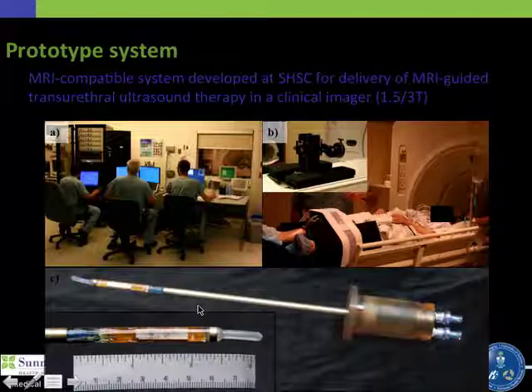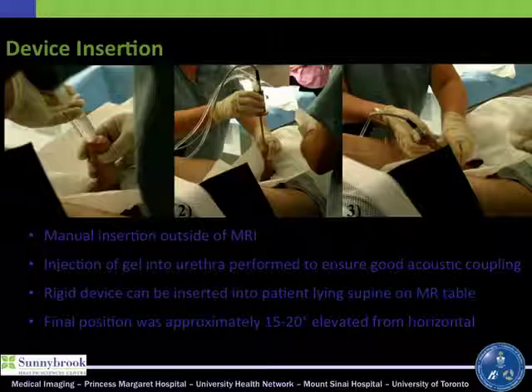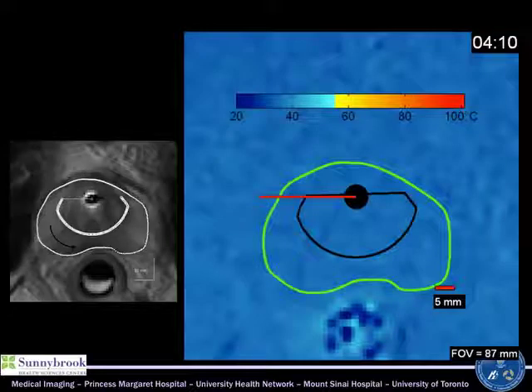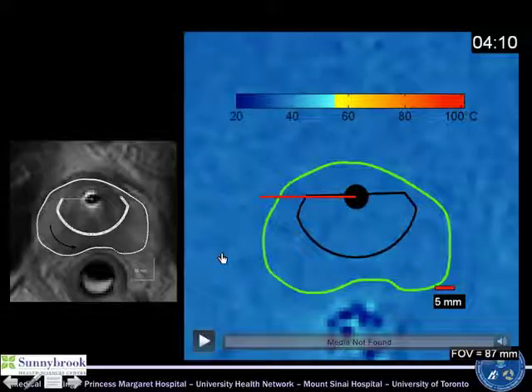This is Laurie Klotz here, and I do all the tracings for this. This is the transurethral device. This has now been commercialized, put into a commercial form with a company, and there is a trial planned in the U.S. So the urologists insert this device. It's about the same diameter as, a little less than, a cystoscope. But this is the cool part, I think. What happens is this is real-time feedback MR thermography.